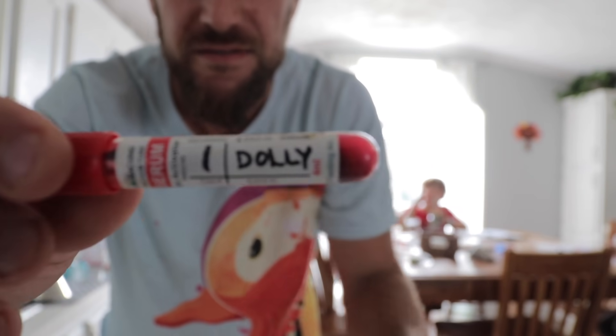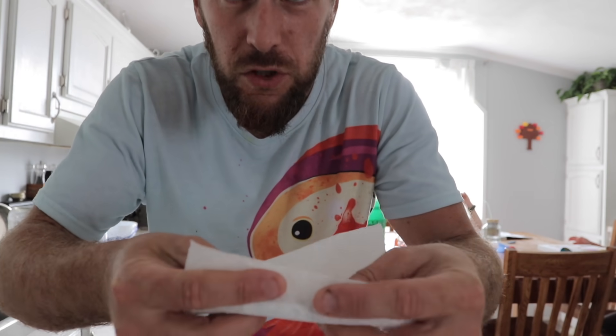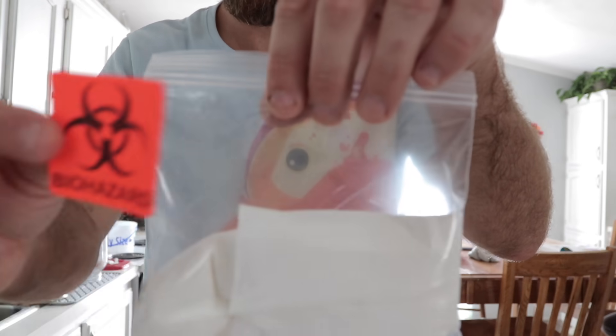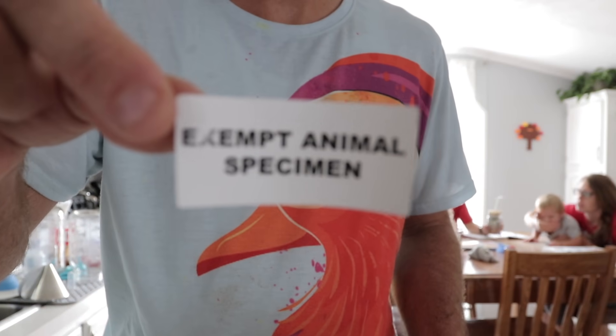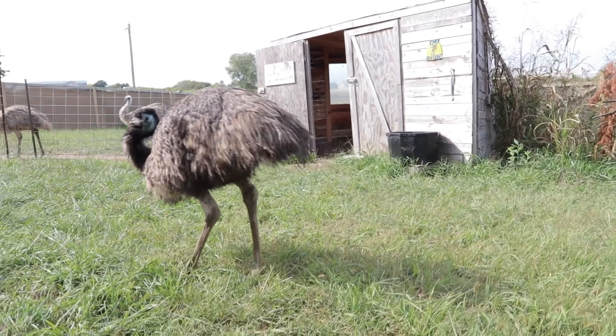We're back in the house, and now I'm labeling the tube to send it away to the lab. This is test number one, and it's for Dolly. We're going to wrap this in some paper towels so if the tube breaks when we send it, it absorbs all the blood. Then I'll put that inside a Ziploc bag with a submission form. We bubble wrap it and put it in our priority mail package with a sticker. We'll send it to a lab in Kansas - hopefully we'll get the results maybe early next week.